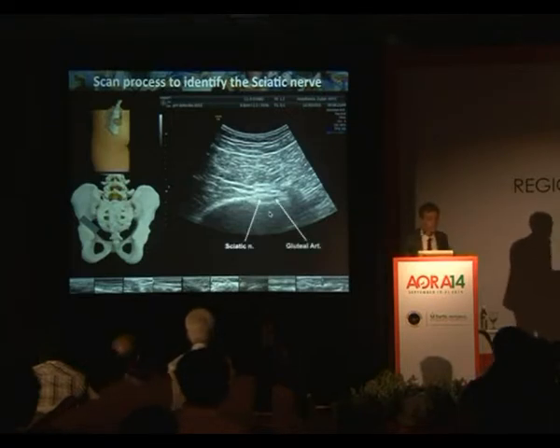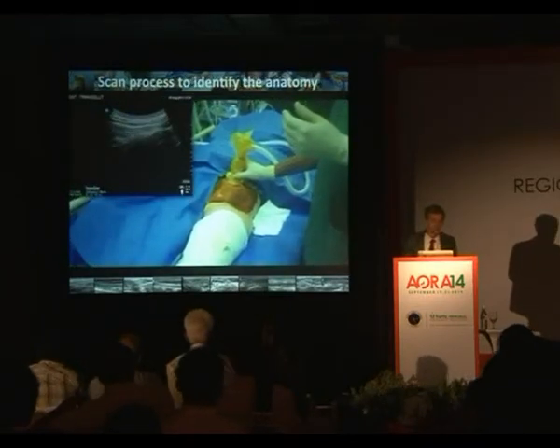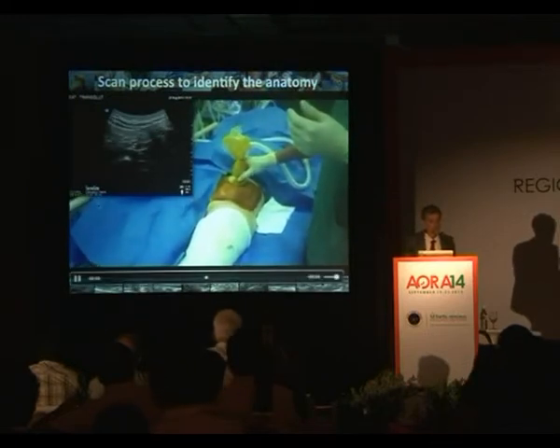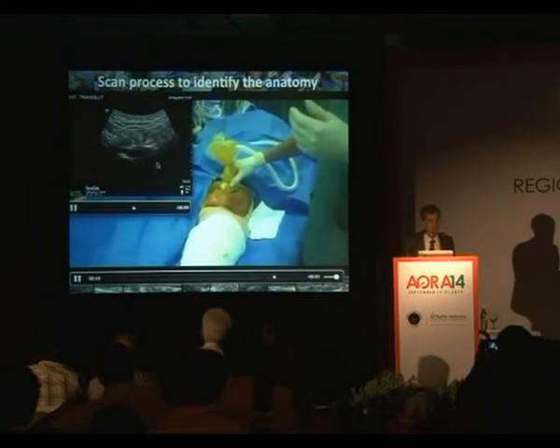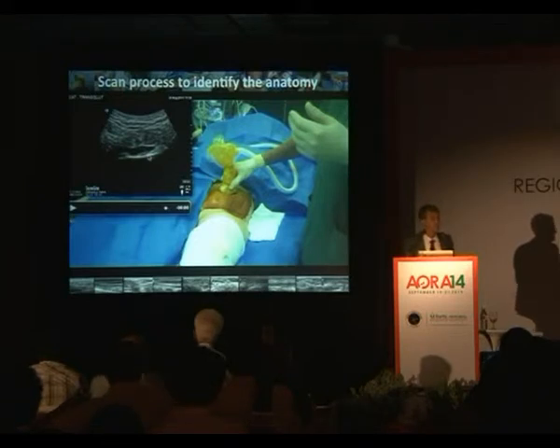And I'm going to show on the videos. Okay, so we're going to start the process again. Very, very simple. I'm going down. I see my posterior superior iliac spine. I go down. I have the slope. I have the echo now. I turn my probe lateral, I extend this line, I'm happy. What do I see here? The pulse. And over it, my sciatic nerve is there. That's it. This is very simple.